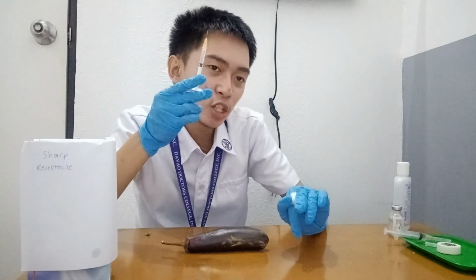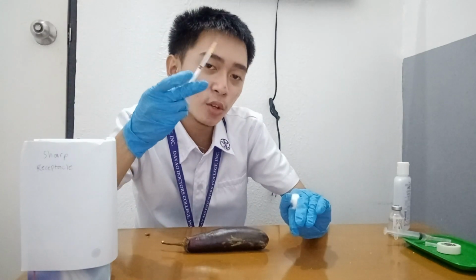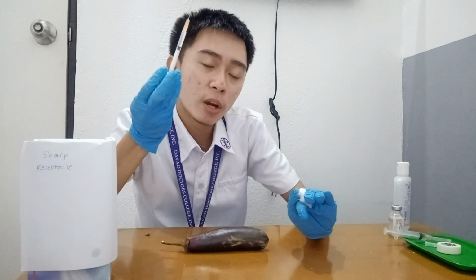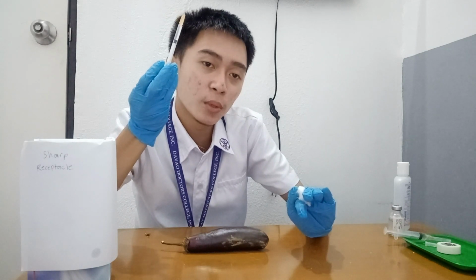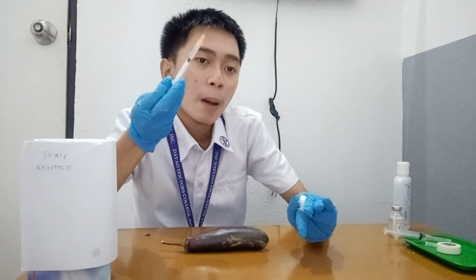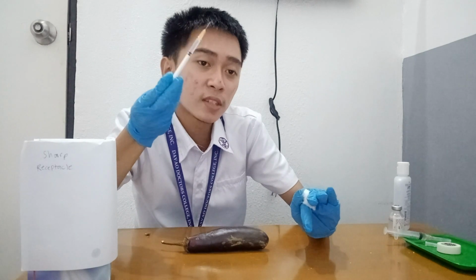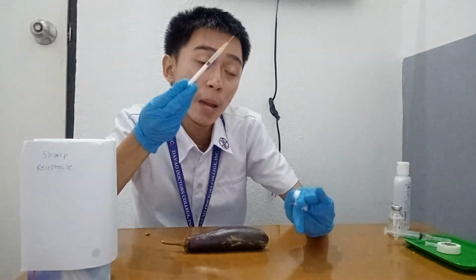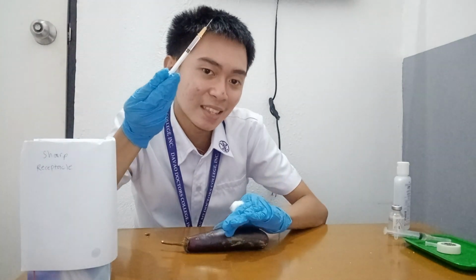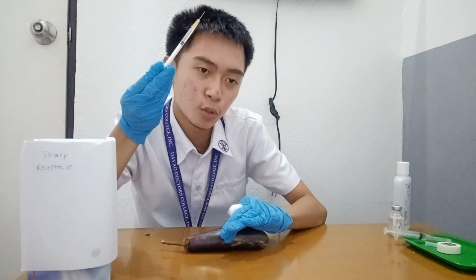And inject the medication. Grasp the syringe in your dominant hand, holding it between your thumb and fingers with the palm facing up or to the side for a 45-degree angle insertion, or with the palm downward for a 90-degree angle insertion. Prepare to inject. Using your non-dominant hand, pinch or spread the skin at the site and insert the needle using the dominant hand in a firm, steady push.